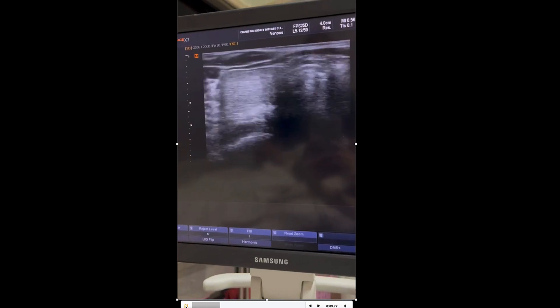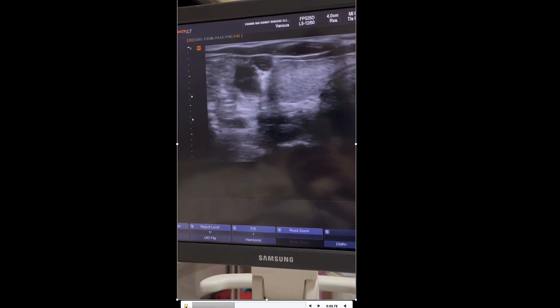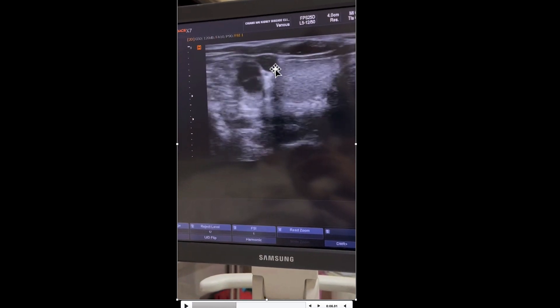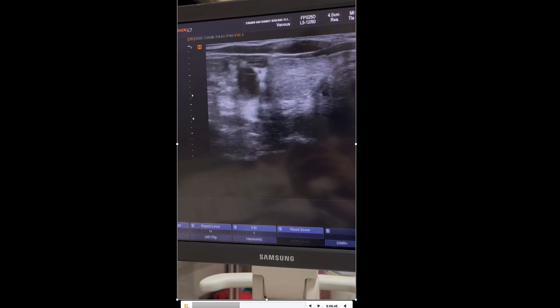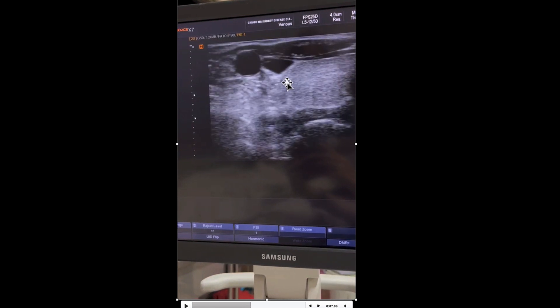And then when you look lateral, this is what you normally see here — near the thyroid, you would see the artery first. But look what happened in this patient. So this is the surprise: this is the thyroid, this is the internal jugular vein, and this is the artery. So basically there is a switch in position. I'm going to compare with a normal patient here.